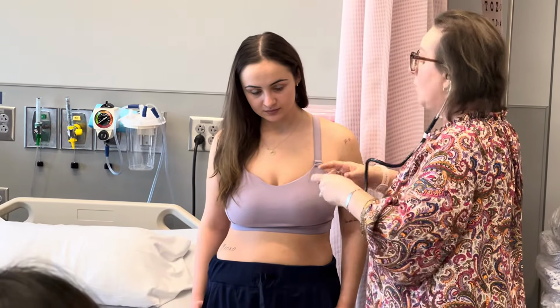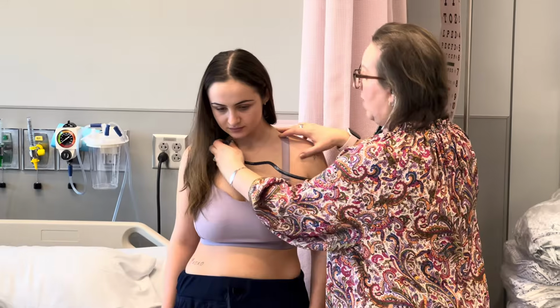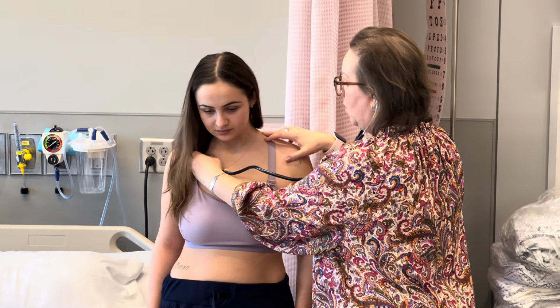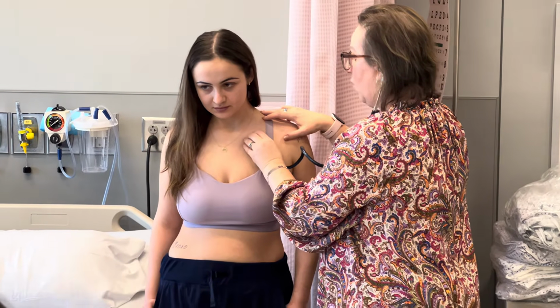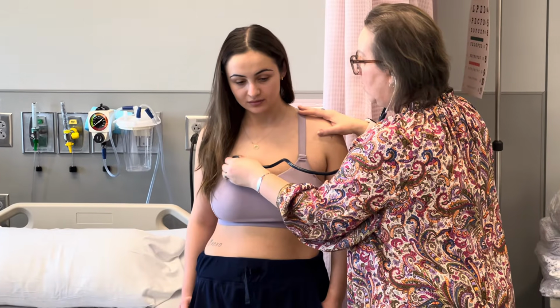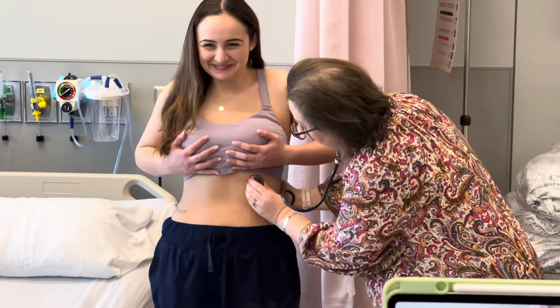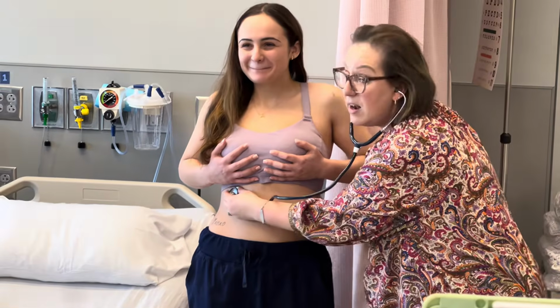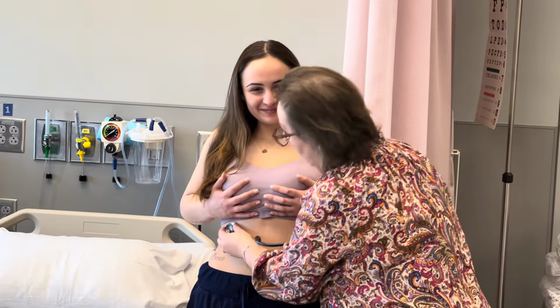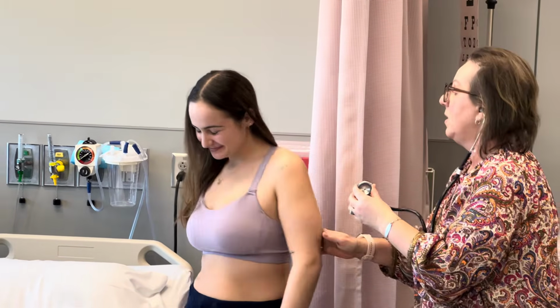All right. I want you to take a deep breath every time you feel my stethoscope move. So 1, 2, 3, 4, 5, 6, 7, 8. Can you lift your breast again for me? 9, 10. Now with 11 and 12, we go lateral. 11, 12. Okay, turn around.